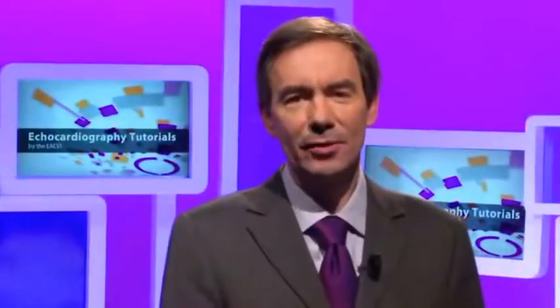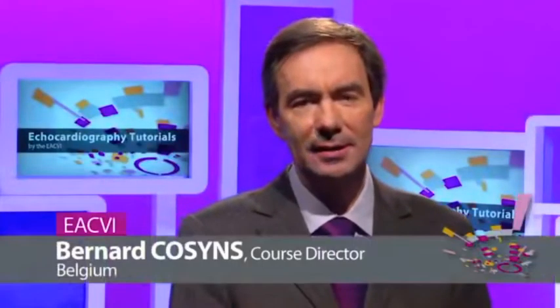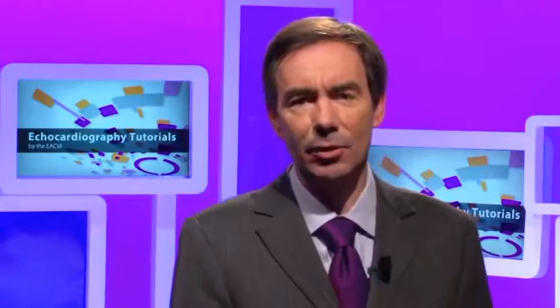Dr. Mourar will now show us how to assess primary tricuspid regurgitation. She will first focus on the morphology of the valve and how to assess the morphology and the mechanism of the tricuspid disease, and then she will move on to the way to assess the severity of tricuspid regurgitation.